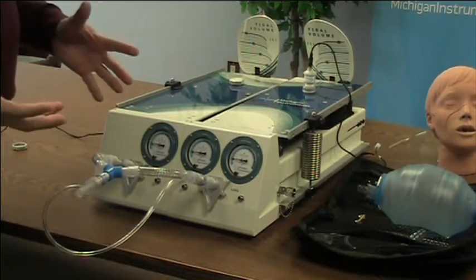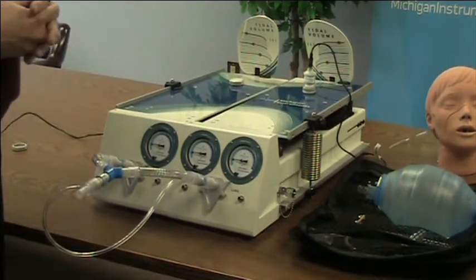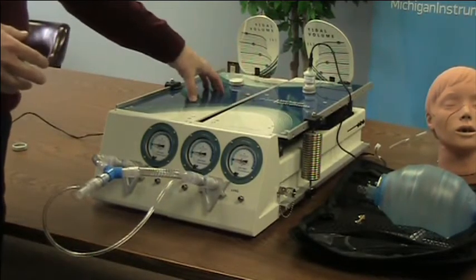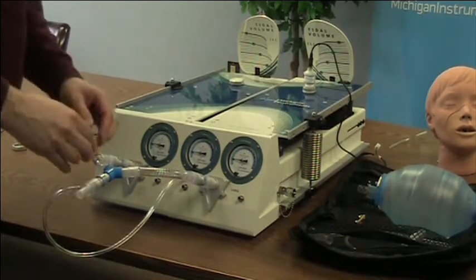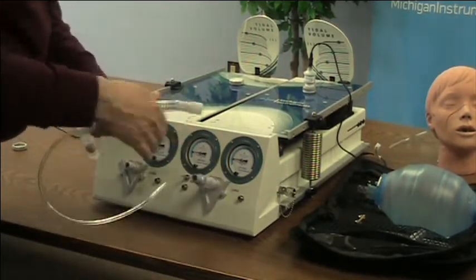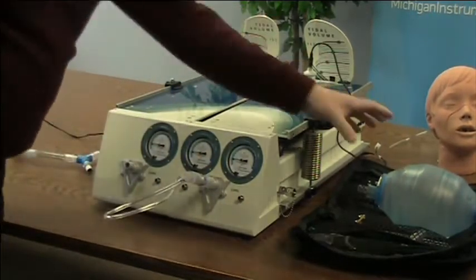You can also simply ventilate one side of this TTL, because each lung has a capacity of two liters, which is well within the typical range of ventilation for adults. To do that we simply need to take some of these components out of the way, and now we have that set up.